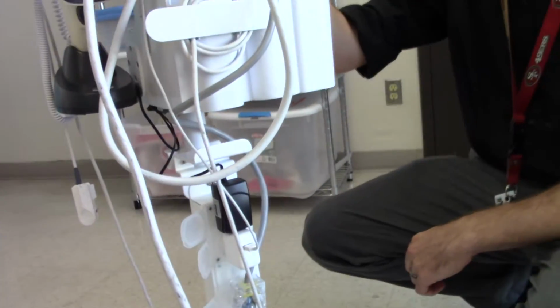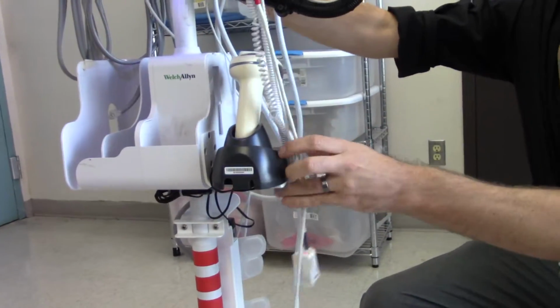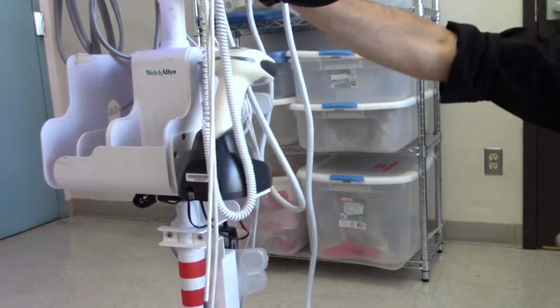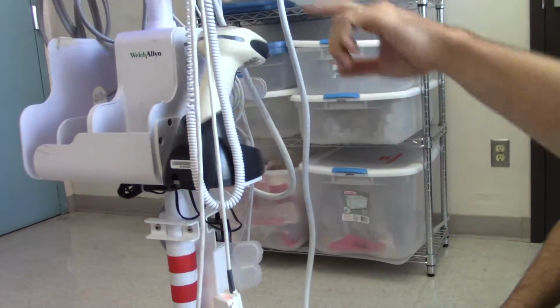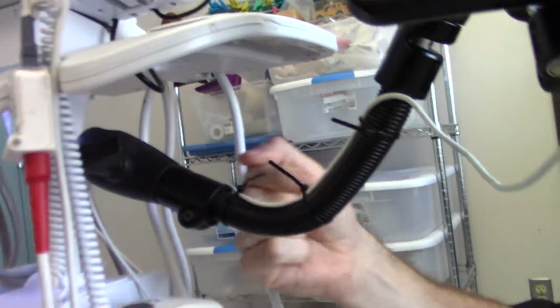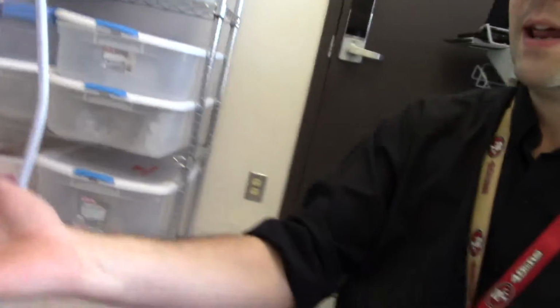Now, are there any other problems? I noticed, how about with the way these are mounted? The scanner mounts are actually really good. The problem with the scanner mounts is, and you'll see once I get you the billable list of parts, I'm still waiting on the quote back from our vendor. Sure. So I have a similar setup that we use for these where it's a U-bolt that comes into an arm. It's a rigid arm rather than a flexible arm. Oh, on the scanner? Correct.